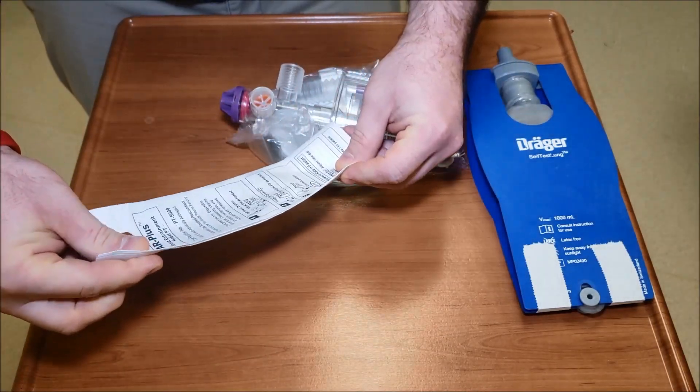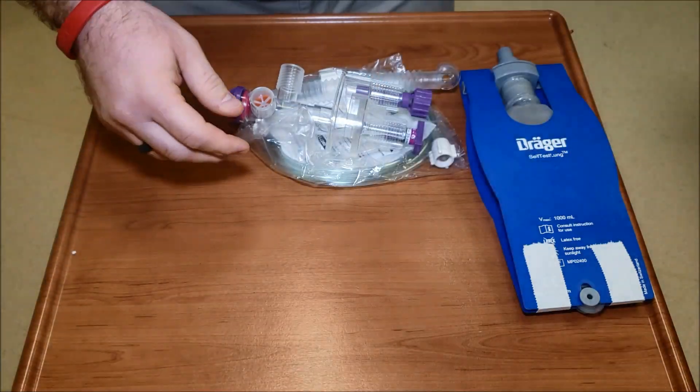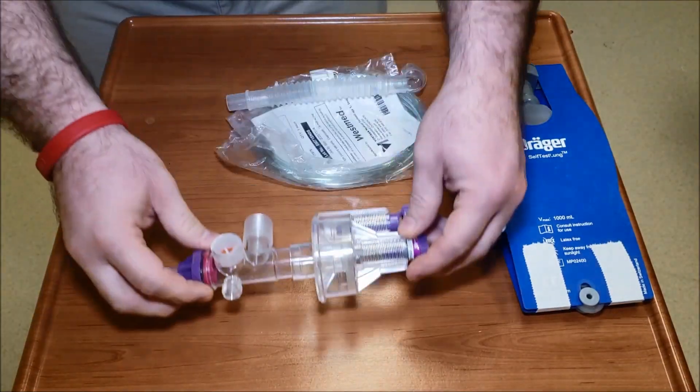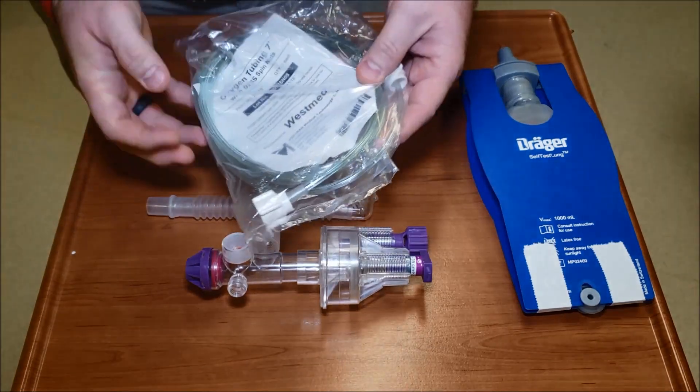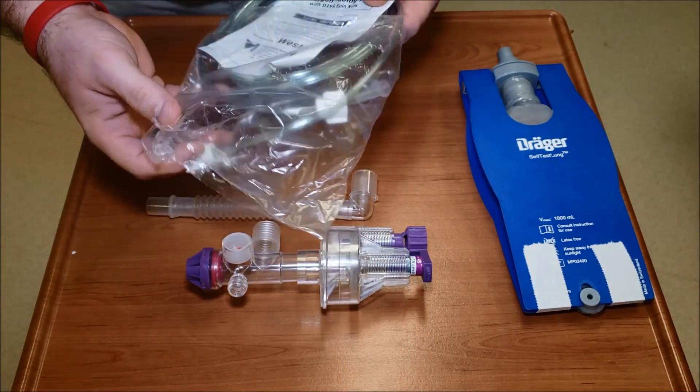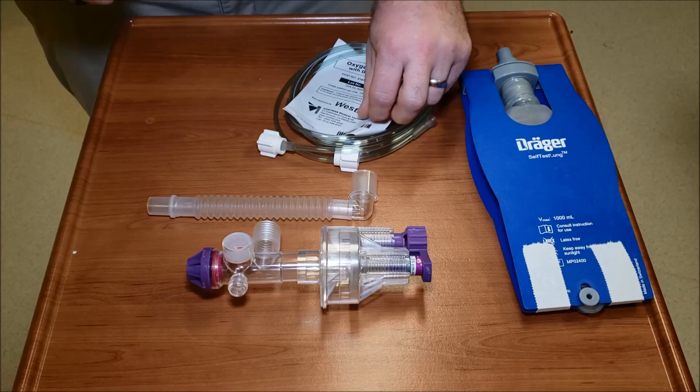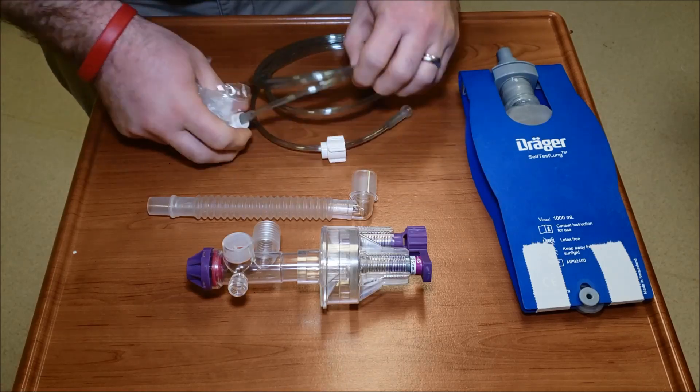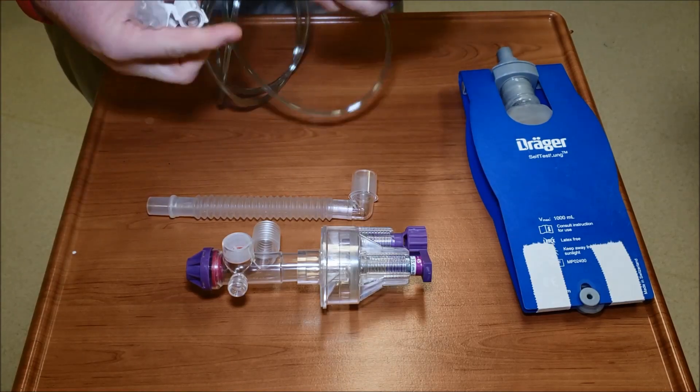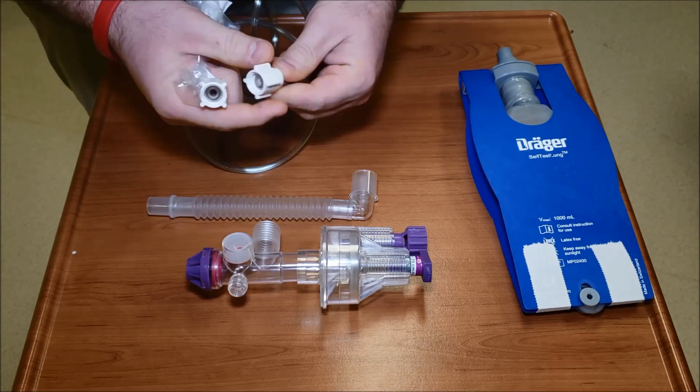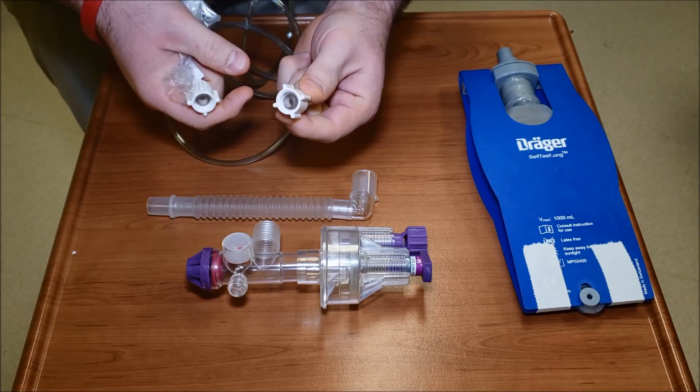We have a couple different pieces. Obviously this is the easiest one to look at - this is from WestMed, this is the oxygen tubing for it. You can see that it has adapters on both sides. This will actually screw directly into the flow meter.